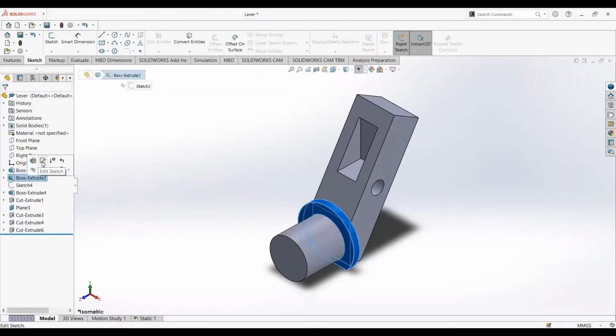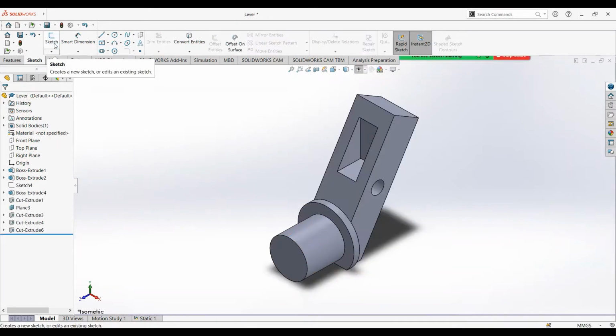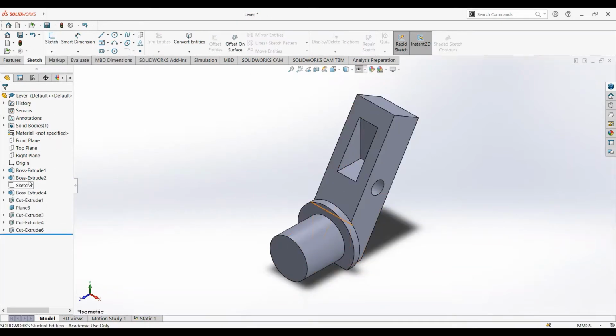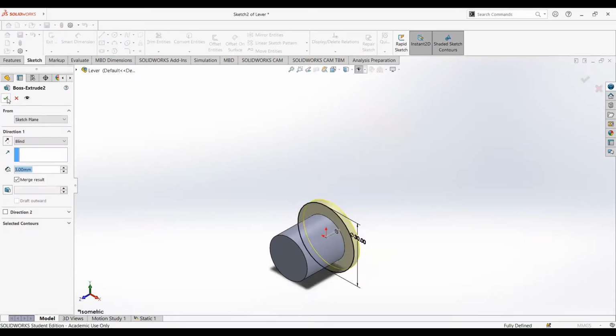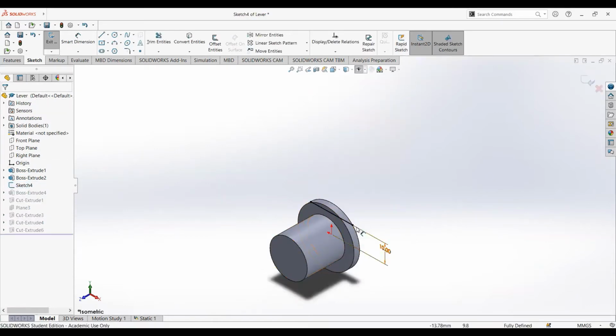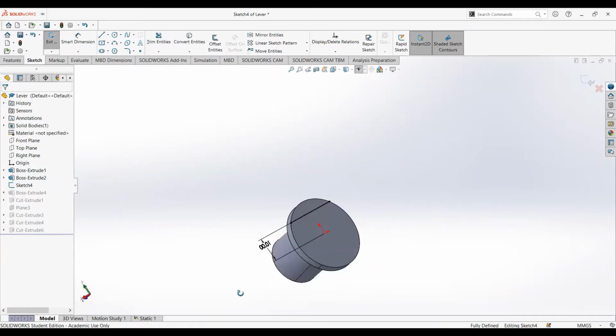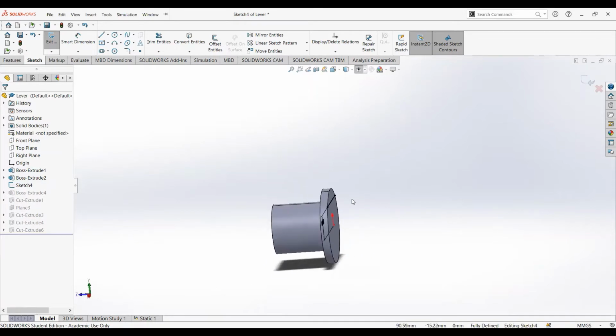Next, we sketched another circle by 30 diameter. And then we extruded that part as well by 3 millimeter. Next, we sketched a line right here, and the distance from the line to the origin is 10. We use this line, I'll show you in the next step why we use this line right here.